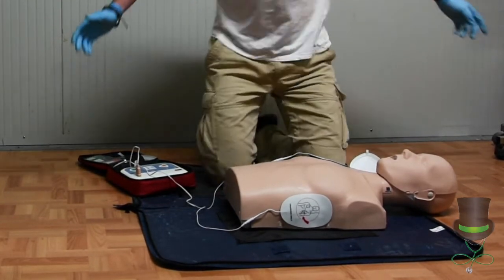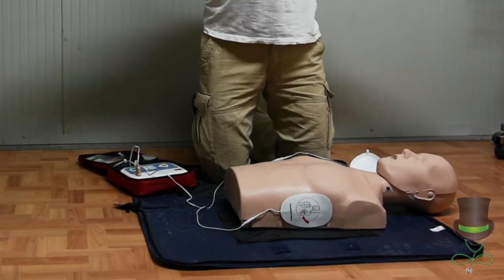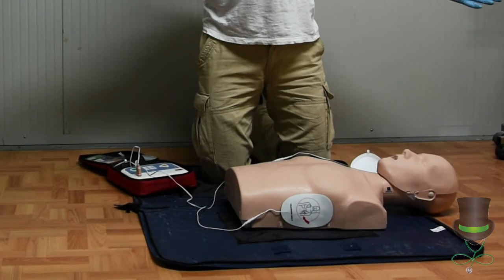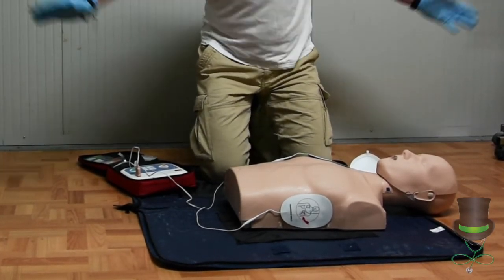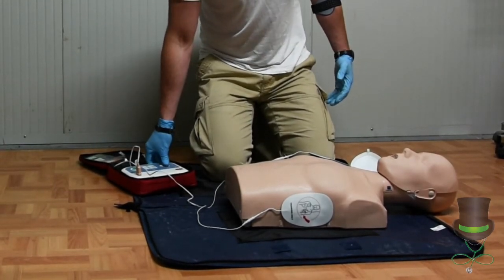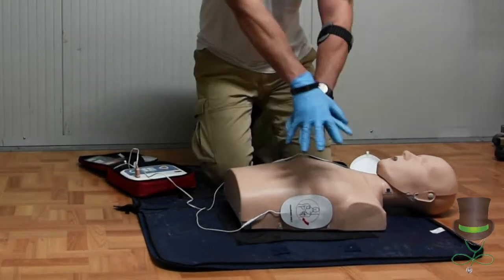Analyzing heart rhythm. Stand back from the patient, shuffle back. Ensure no one else is touching the patient. It's analysing the heart rhythm. Shock advised. Shocking now, stand clear. Stay clear of patient. Shock delivered.